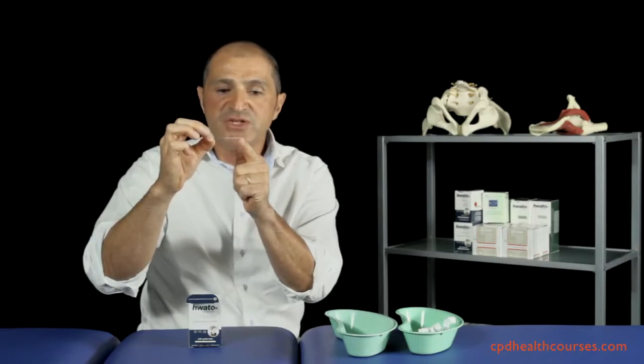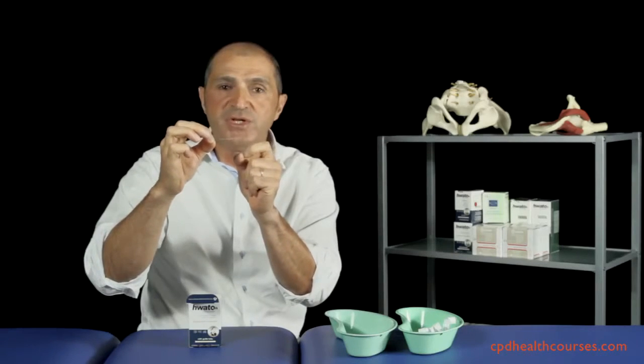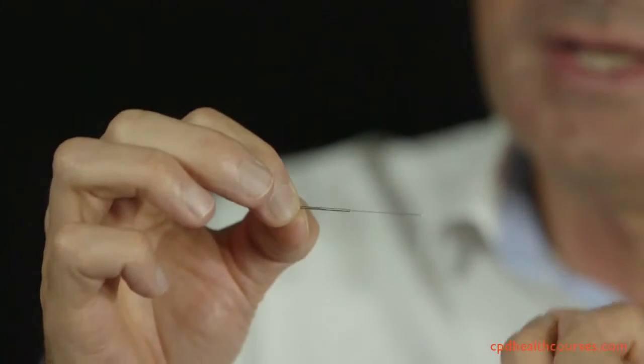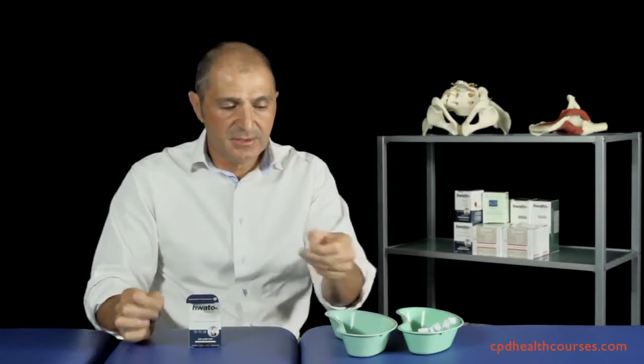Importantly, this shaft here, that's the 30 millimeters of shaft. It has a needle end here, and that's not actually that pointy. It's actually rounded, and that makes it more comfortable when you're placing it into muscle tissue. So that's the acupuncture needle. Let's have a look at what happened before that, how to get that acupuncture needle.